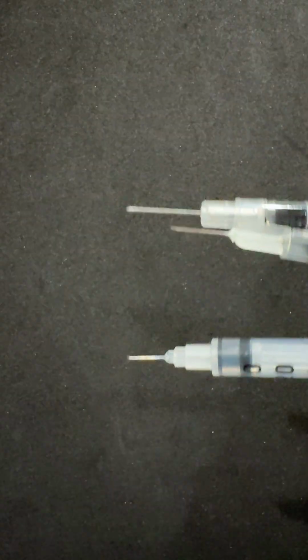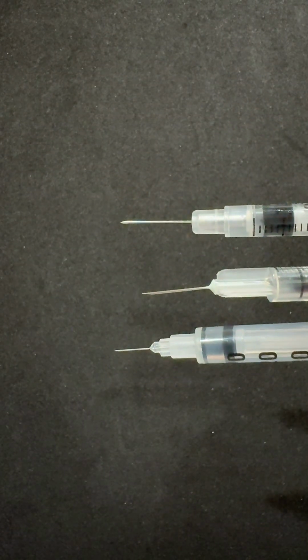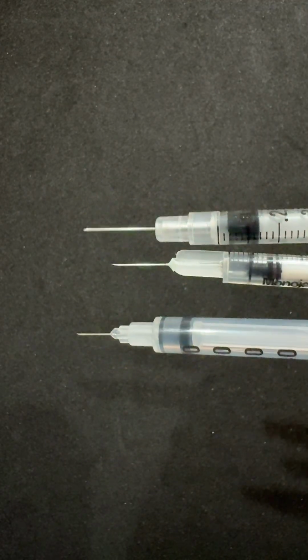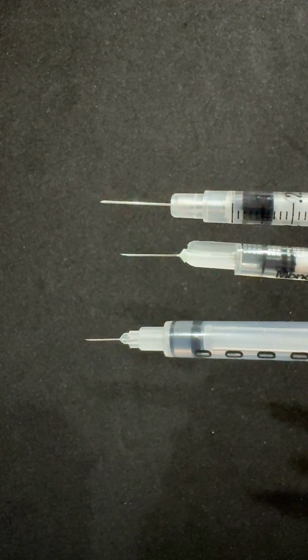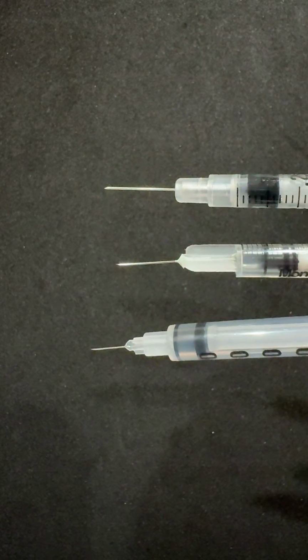Very, very short. So our common lengths of needles tend to be anywhere from 5/16 up to 5/8 of an inch if we're going to give an injection subcutaneous. I don't need a super long one if I'm just entering into the fatty part of a patient.